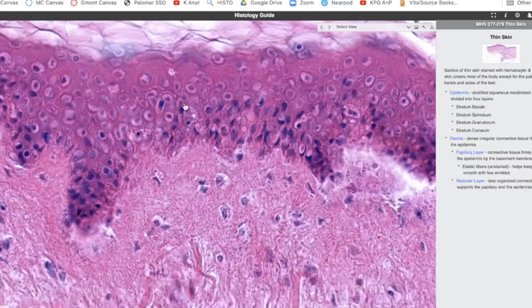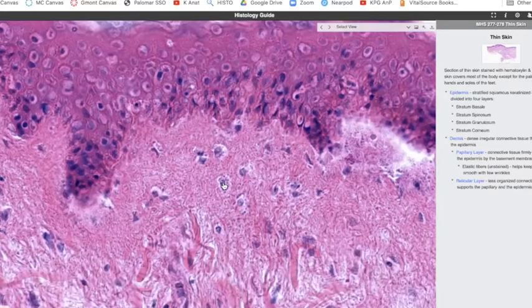So these cells are all stuck together. And then these cells over here are the fibroblasts, right, that are sitting in there. Are they really fibroblasts? Maybe not, but that's what you're going to call them, right? So epithelial and loose connective tissue, this is just stratified squamous dry.